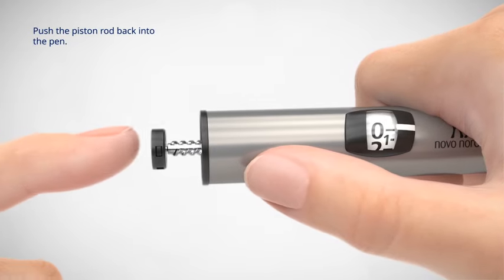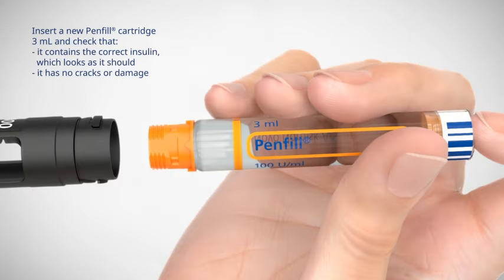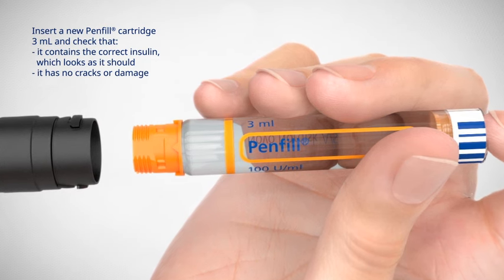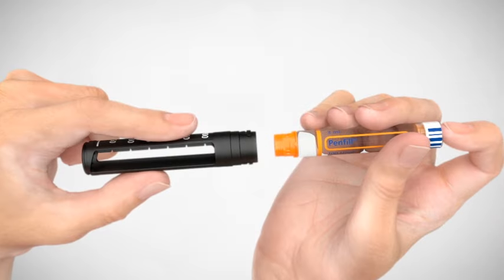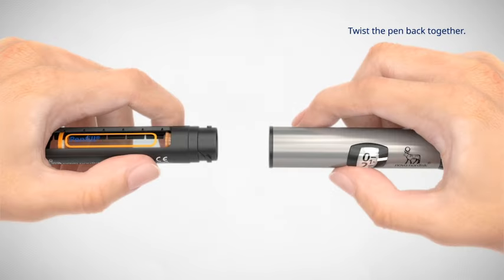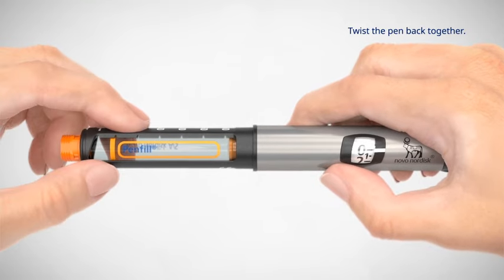If the piston rod is sticking out, push it all the way back in. Check the name and colour of the cartridge to make sure that it contains the type of insulin you need, and check that it has no cracks or damage. Insert the cartridge into the cartridge holder with the threaded end first. Push the pen back together and twist until you hear or feel a click.